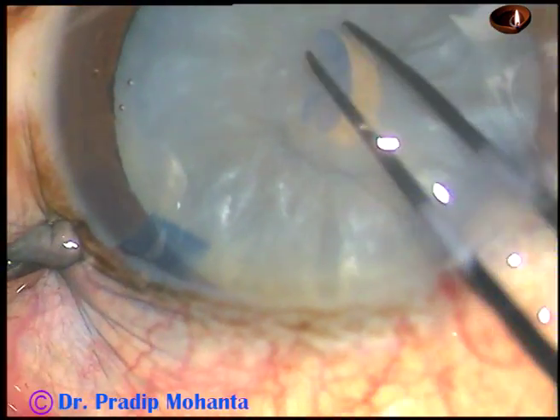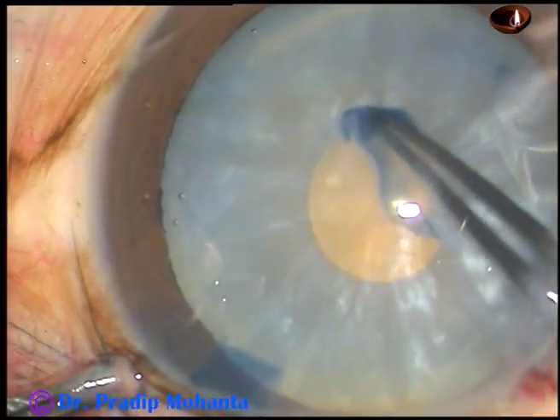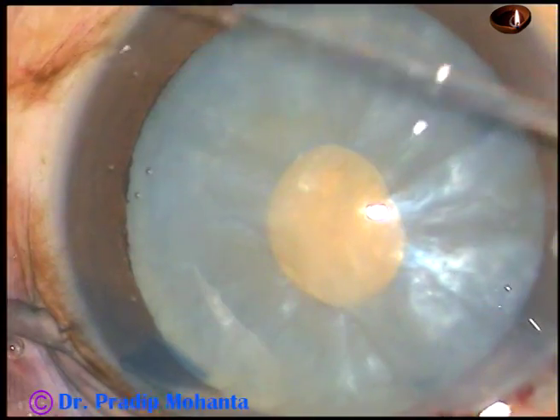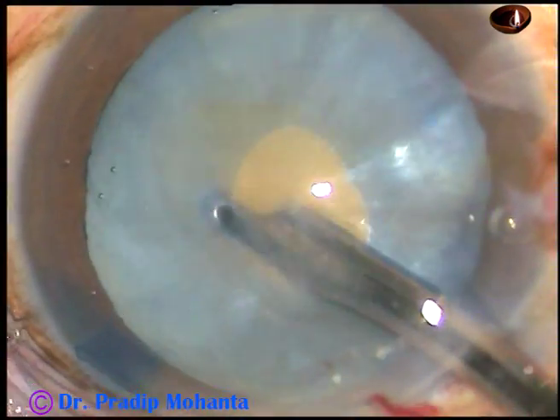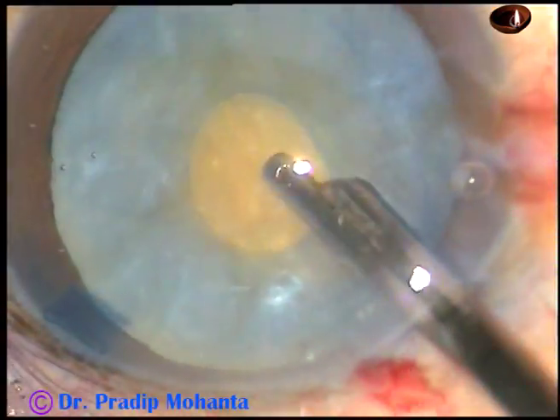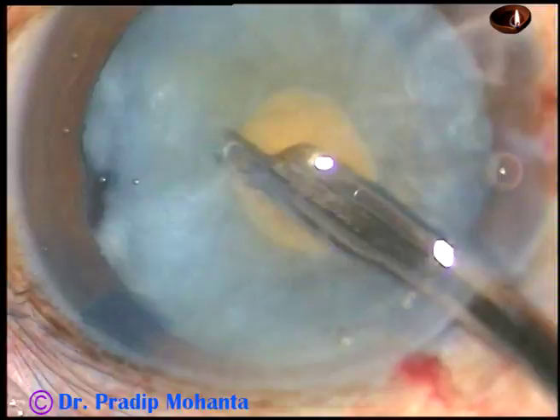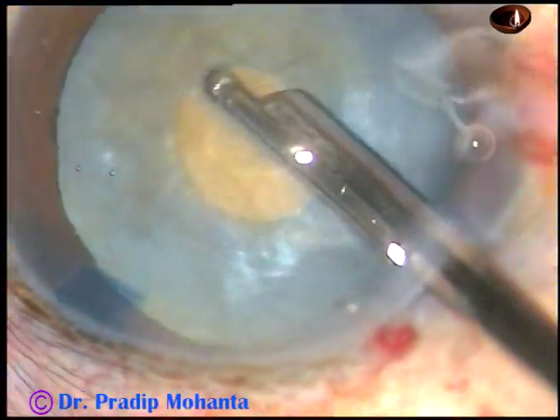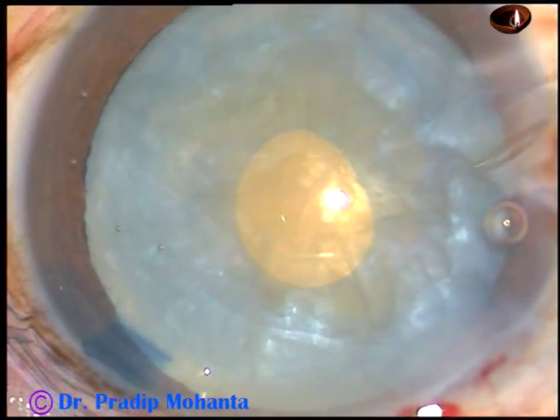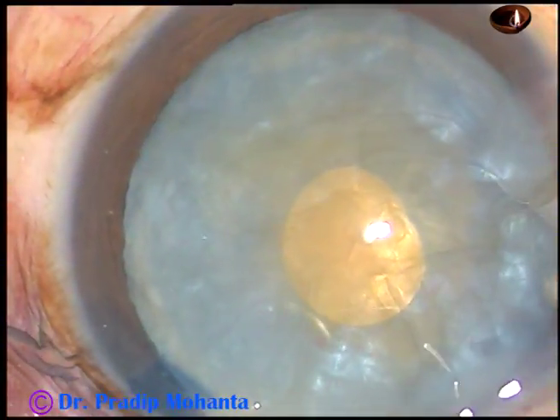And now I make a very small rexis at this stage — I call it a mini rexis. Cortical aspiration is being done to decrease the intralenticular pressure. This is a very good technique: if you aspirate some lens matter through this small opening, the intralenticular pressure will decrease drastically, and the cataract doesn't behave like an intumescent cataract anymore.